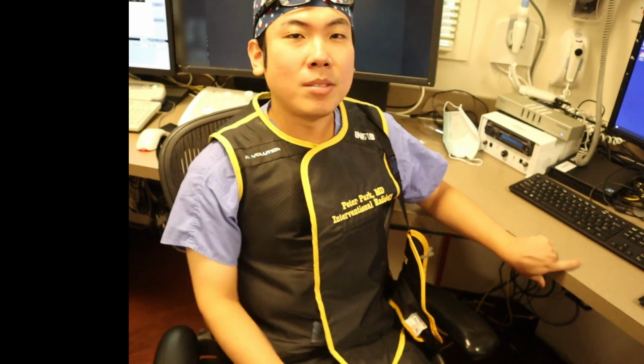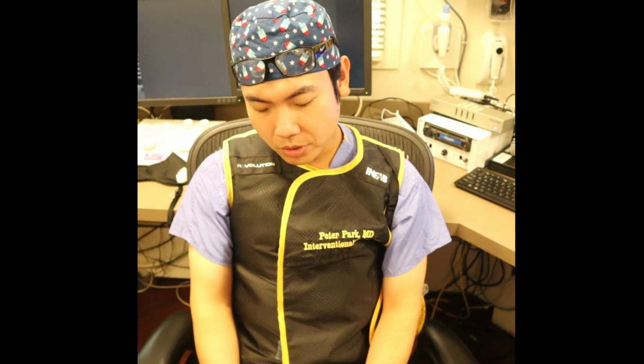Okay. So we'll do the debrief. As you just saw, the procedure, gastrostomy tube placement, is a routine procedure that we do almost every day because there are a lot of patients needing enteric access. Here in this hospital, we take care of most of the G-tube placements under fluoro. It's safe, much less invasive than open surgical G-tube. It is something important to do well, like I was mentioning during the case.